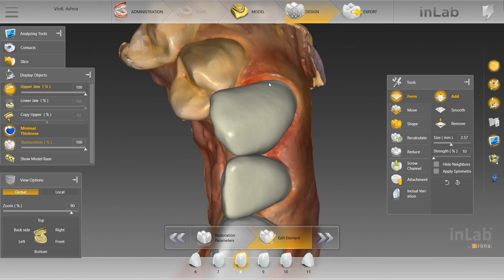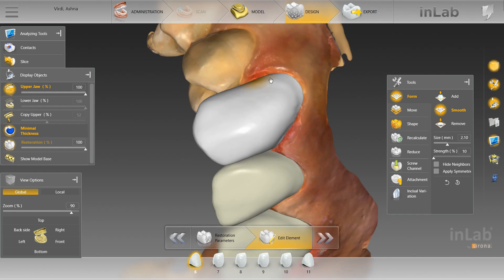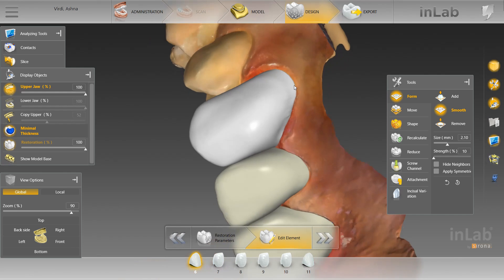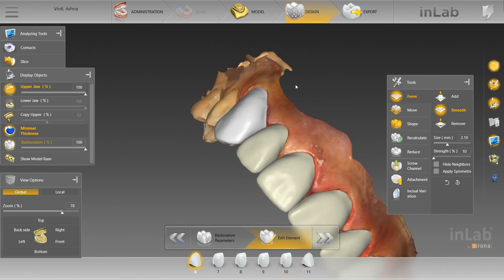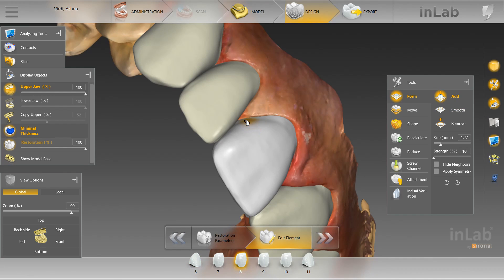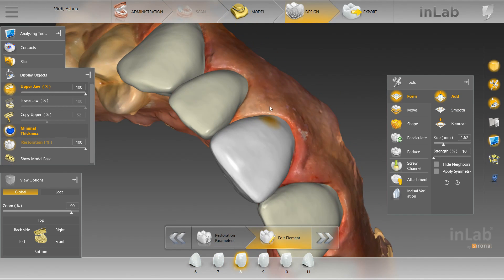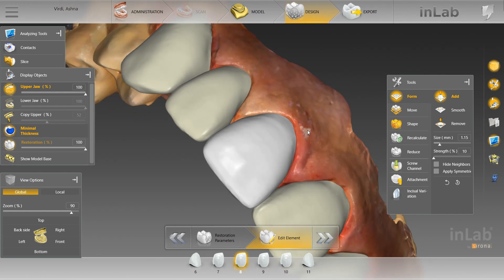I've still got an indention up here — we'll use the add tool. Sometimes it's hard to use the shape tool up at the margin. Smooth it out once again. Do the same thing on this central. See those areas up at the margin — it's hard to get those areas with the shape tool sometimes.